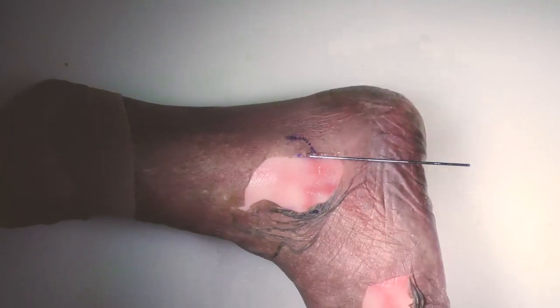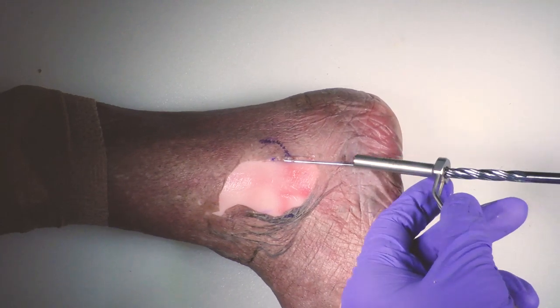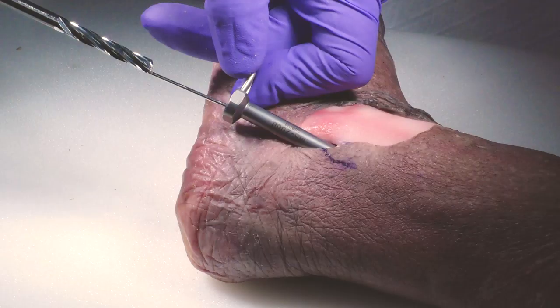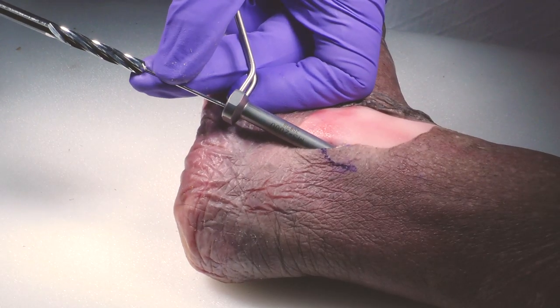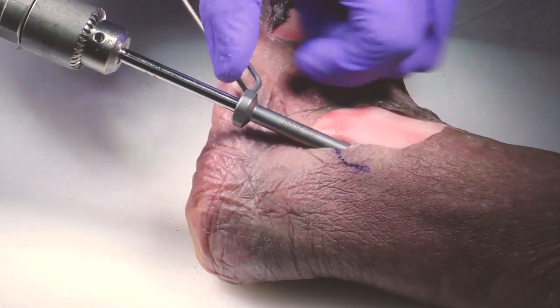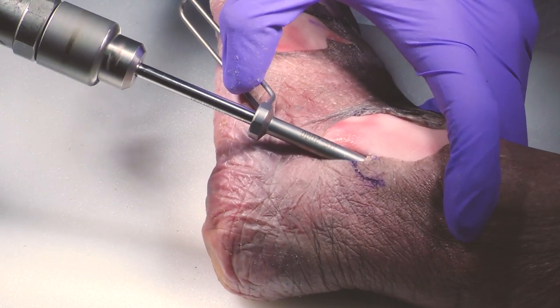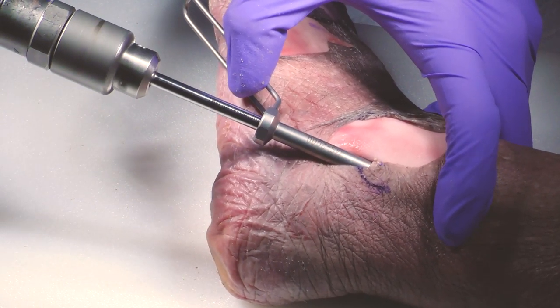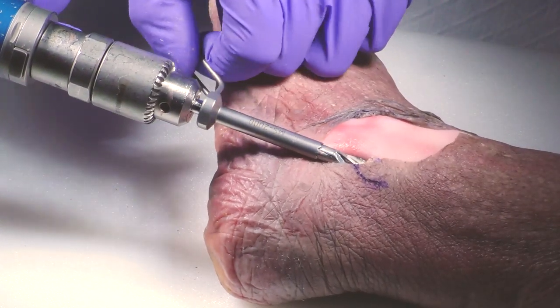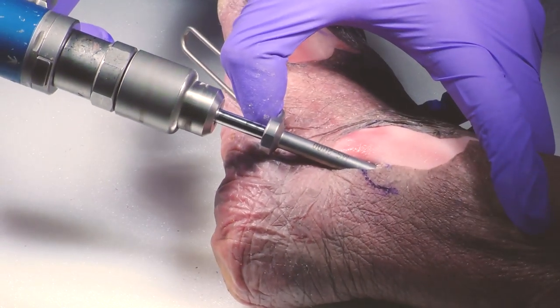Now you see the small incision here — 1.5 centimeters. You need to protect the peroneal tendons as well as the soft tissue, so we will use this sleeve. Look at the drill — it's a 6 millimeter drill and we're going to go in about 4 centimeters, which is about the length of the drill. I can still go in about 1 more centimeter.